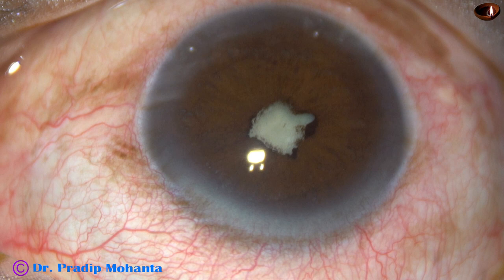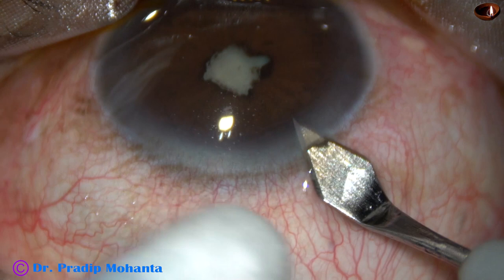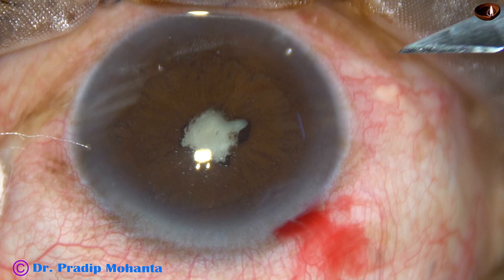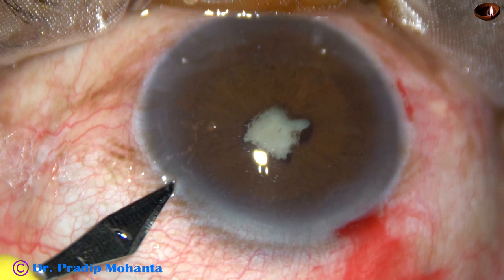This is the main incision on the posterior aspect of the limbus with a 2.8 mm keratome. This is a paracentesis on the right side of the main incision, about 3 o'clock hours away. And this is another side port on the left side of the main incision, about 2.5 o'clock hours away.